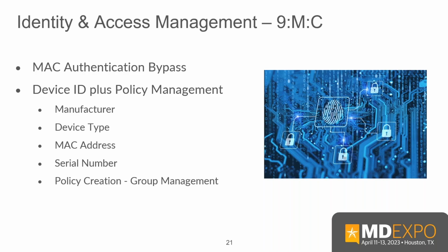And as a matter of fact, even so, if you can see the IP, you can see the MAC address, and you can see the manufacturer, a lot of people will say, okay, well, that's enough for me because my infusion pumps have the Summit Data Communications network interface card, because that's really the MAC address I'm seeing. I'm not seeing the MAC address of the device. I'm seeing the MAC address of the NIC card. And so I'm going to put a network policy in place to lock down all of these devices that have that card and call them infusion pumps. But guess what? Patient monitoring systems use the same NIC card.